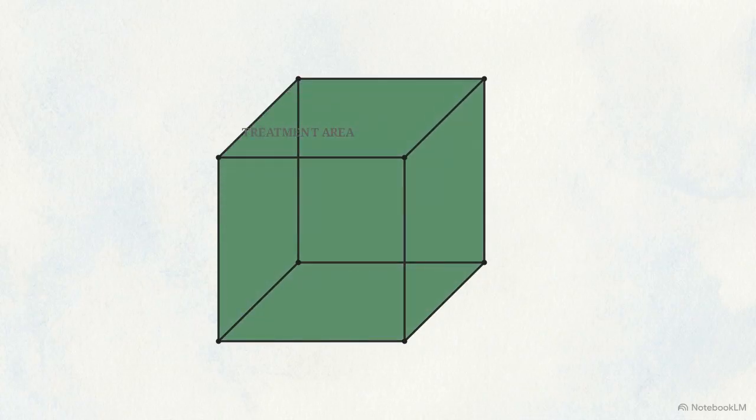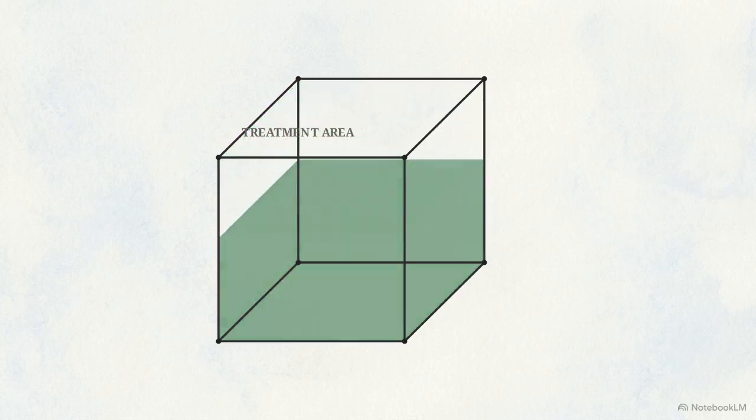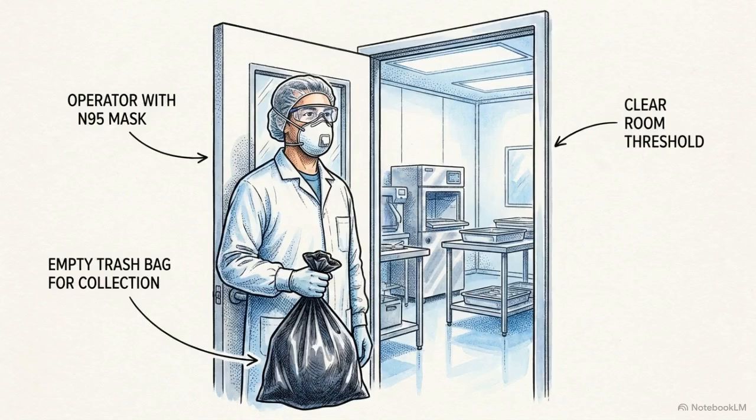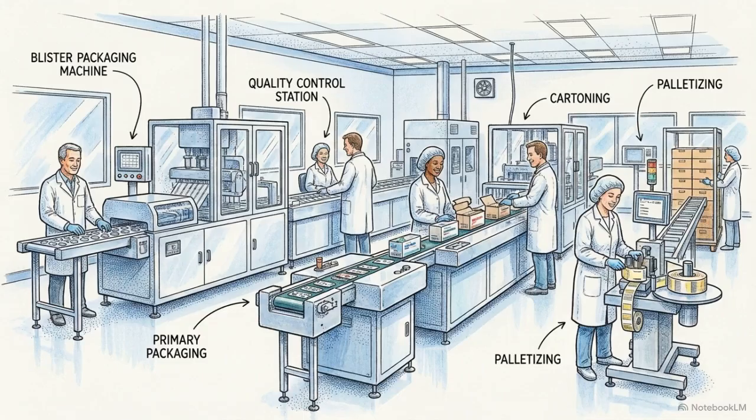Once contact time is complete, begin the purge. Turn on all exhaust fans, open fresh air intakes, and switch the air handling unit to full exhaust mode. When initially re-entering the purged room to retrieve the used trays, operators must wear a standard safety mask. Executing this thorough ventilation process ensures the facility air is safe for your workforce to re-enter and resume standard operations.